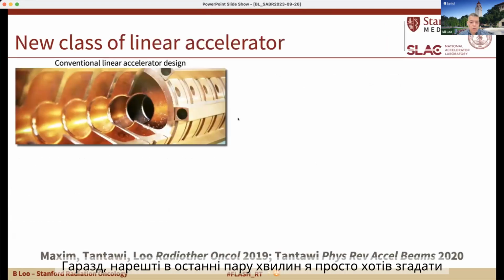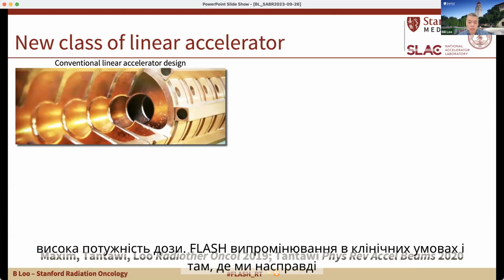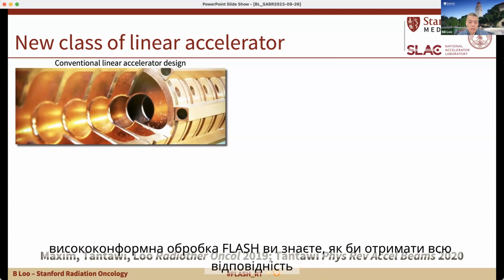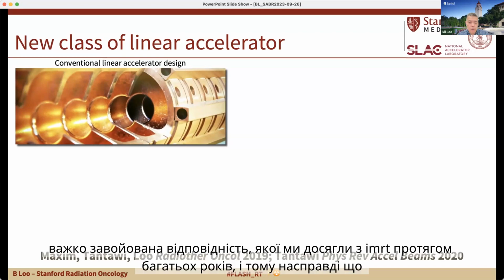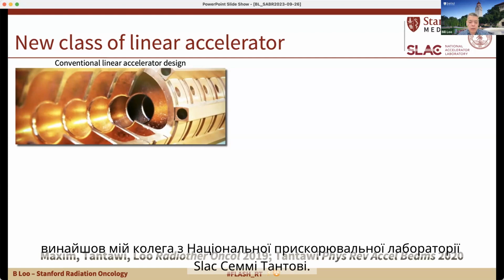All right. So finally, in the last couple of minutes, I just wanted to mention work that we're doing to clinically translate ultra-high dose rate flash radiation to the clinical setting. And what we're really interested in doing is not just ultra-high dose rate, but highly conformal flash treatment, kind of getting all of the hard-won conformity that we've achieved with IMRT over the years. And so really what that requires is a new class of accelerator technology, which, as it happens, was invented by my colleague at SLAC National Accelerator Lab, Sami Tantawi.